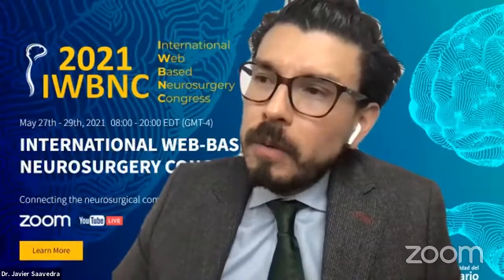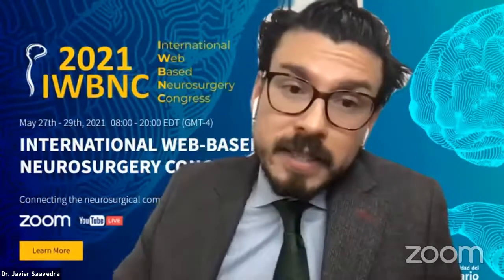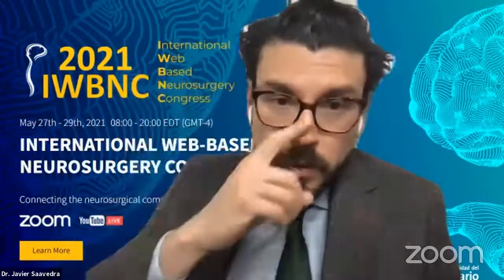Okay, and what about the encephalocele? Have you had any case? I don't, but it has been reported. Usually, you don't have to reconstruct the orbit, but if you have a very, very wide defect, you can use a Medpor. So some people are using Medpor, which is readily available, and it's very easy to use for reconstruction.